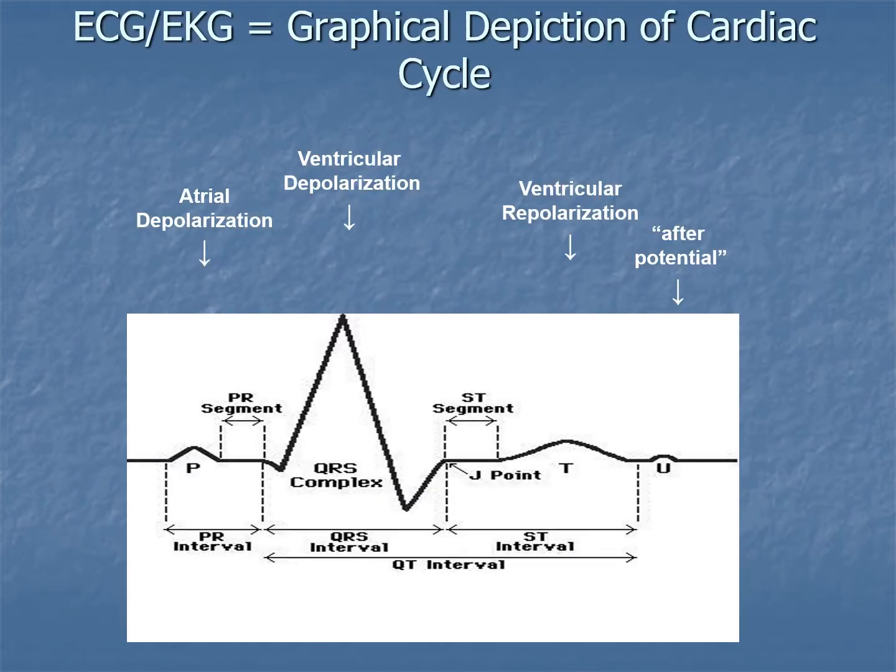An ECG or an EKG is simply the graphical depiction of that cardiac cycle, if you will, the conducting cycle. And we look at P waves, and P waves correspond with atrial depolarization.